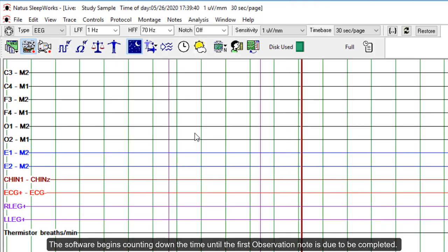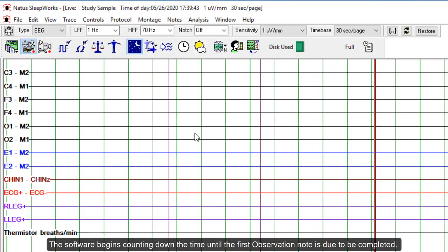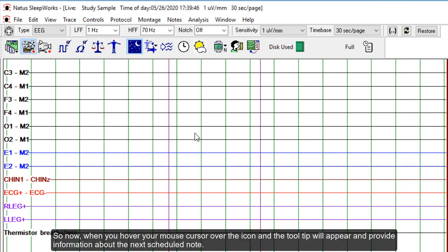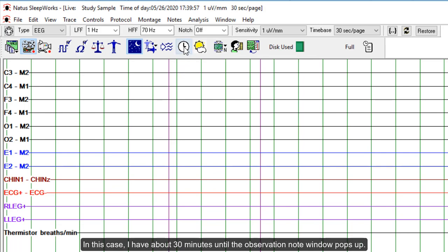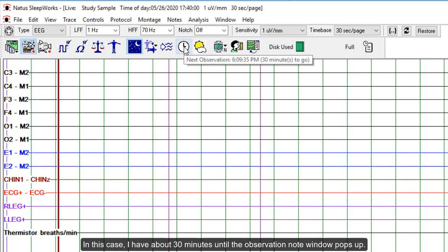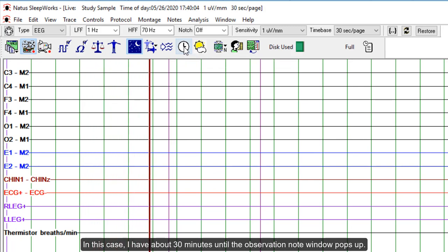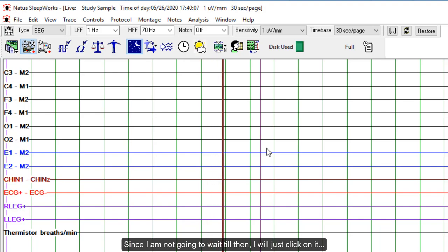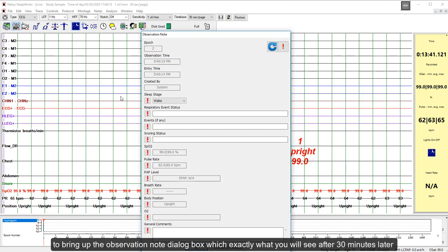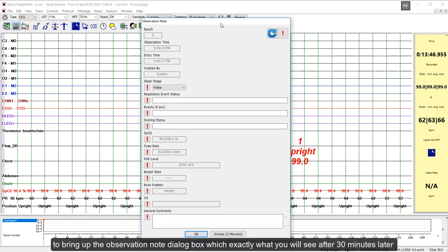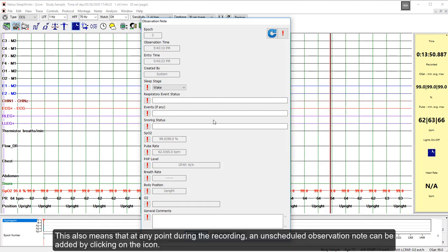The software begins counting down the time until the first Observation Note is due to be completed. When you hover your mouse cursor over the icon, a tooltip will appear and provide information about the next scheduled note. In this case, I have about 30 minutes until the Observation Note window pops up. Since I am not going to wait till then, I will just click on it to bring up the Observation Note dialog box, which is exactly what you will see after 30 minutes.